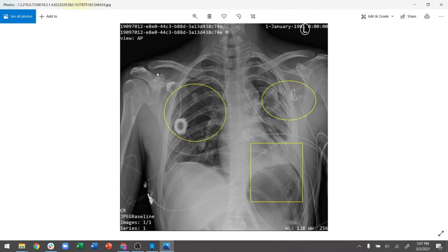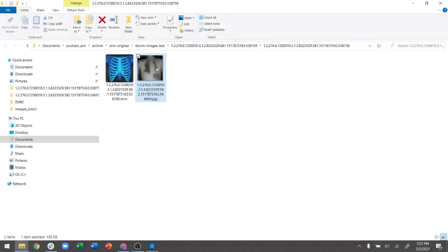This kind of annotation is not very useful for machine learning models, because you generally need an image along with a file that tells you the exact bounding box locations, or another image where the annotated area is white and all other pixels are black — that becomes your bitmap equivalent of labels for your machine learning models.